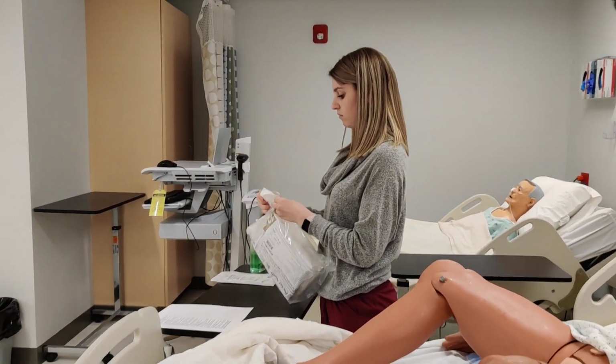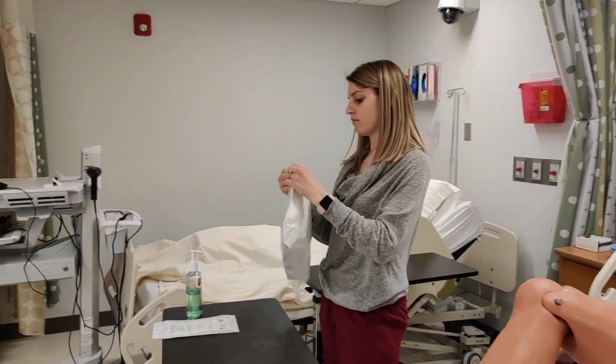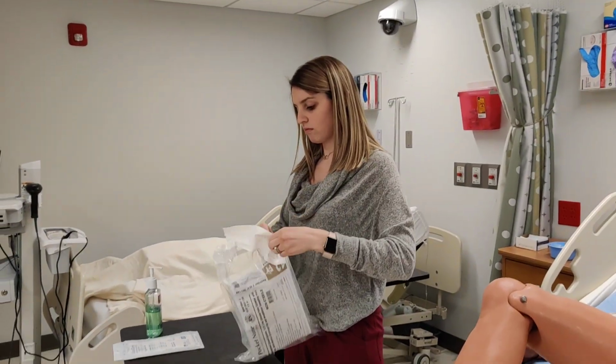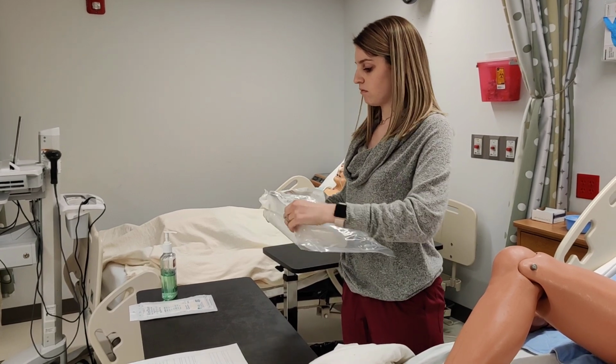Now, for the purposes of setting up her supplies, Gabby has 2 tables available to her. Remember, we're looking at maintaining sterility. We're really focusing on patient safety and those principles, not necessarily how you set up your Foley kit.